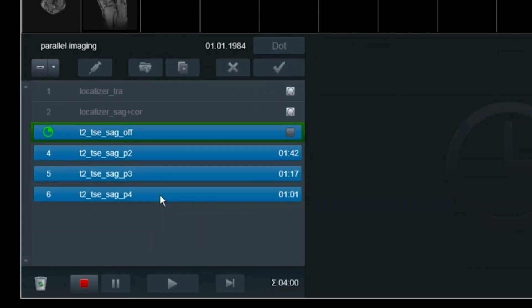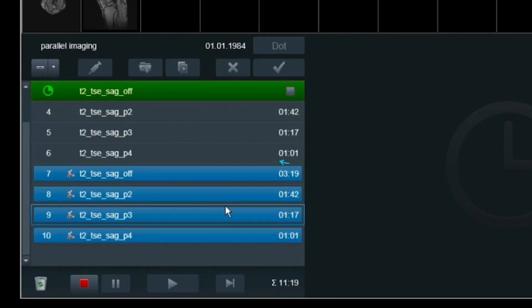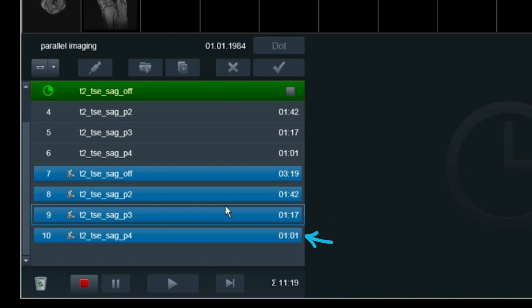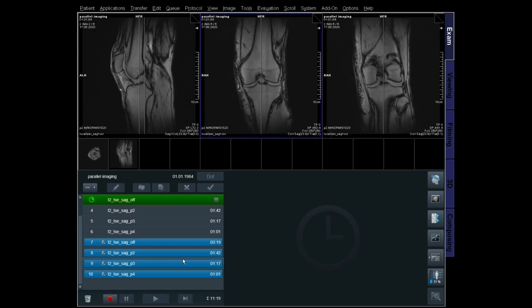I'm just going to copy these four scans to compare the scan times. We went from 3 minutes 19 seconds without PAT, then PAT2 at 1 minute 42, PAT3 at 1 minute 17, and PAT4 at 1 minute. So we save a lot of scan time using the parallel imaging approach. But how far can we push it, given we're losing a lot of SNR? Let's check this out.